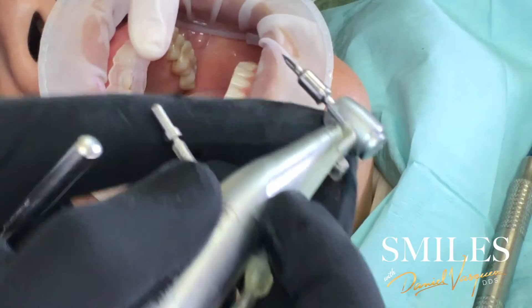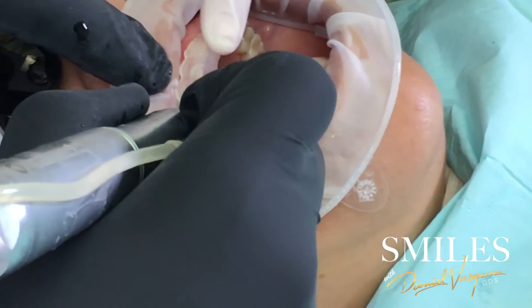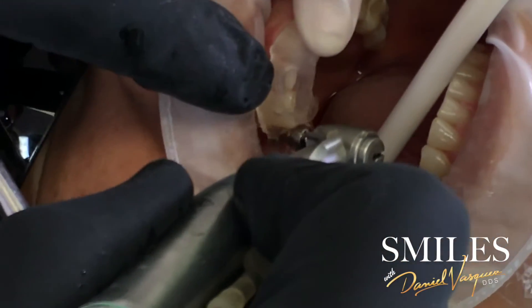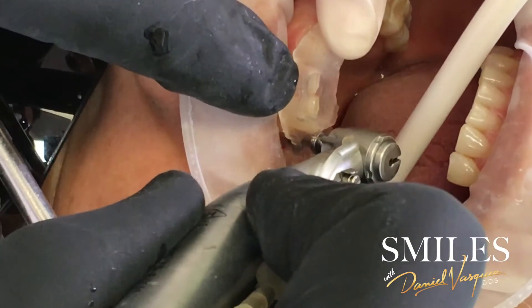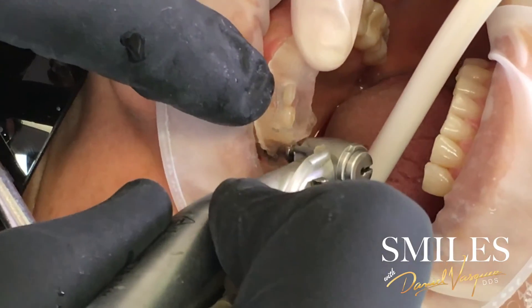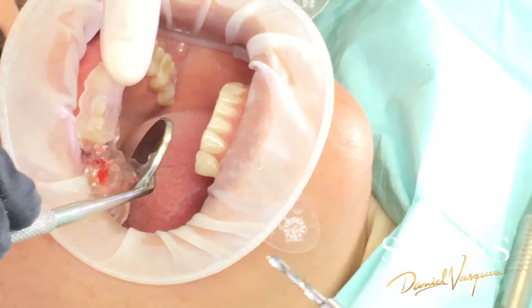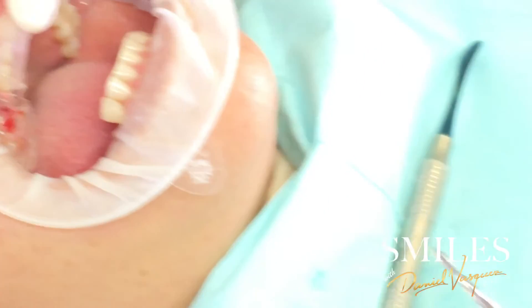Next, this is a pointy drill, so it's going to help me guide my... Beautiful. This is a Megagen implant — it's a 3.5 by 11.5.